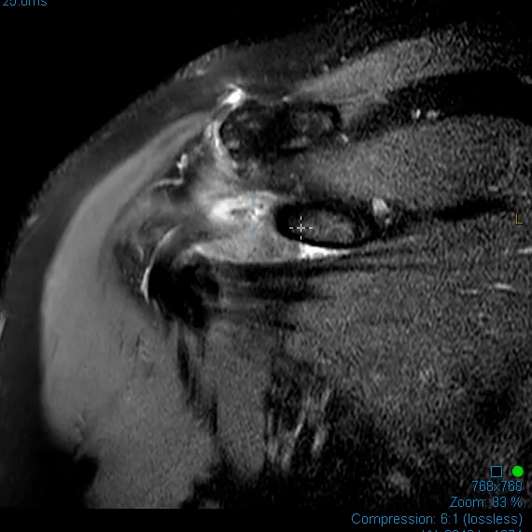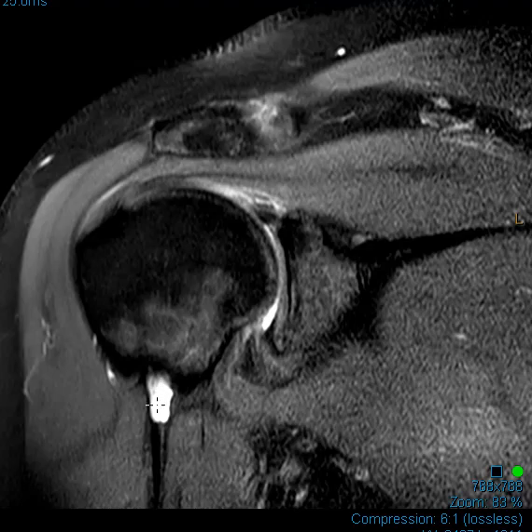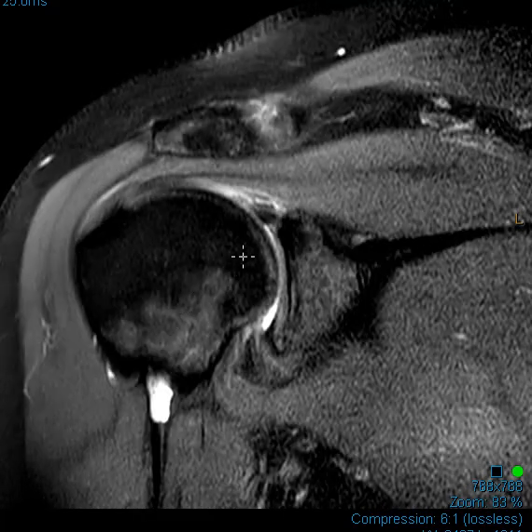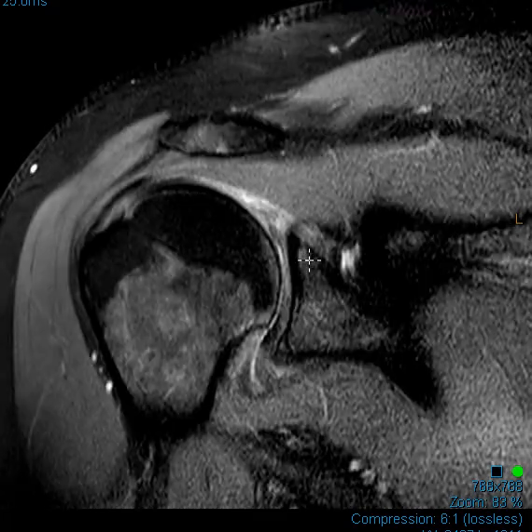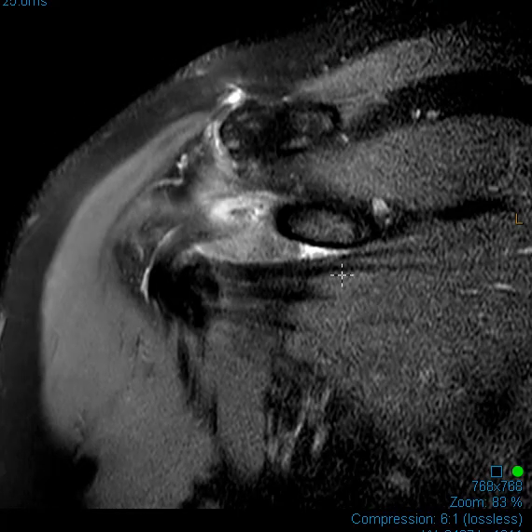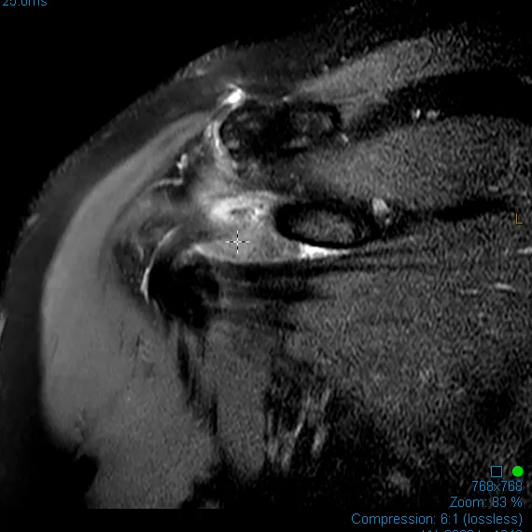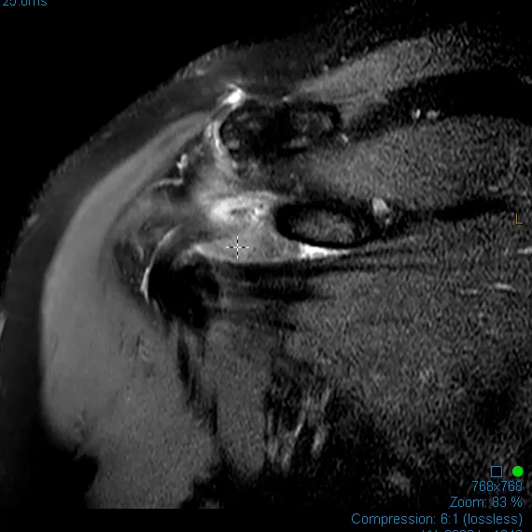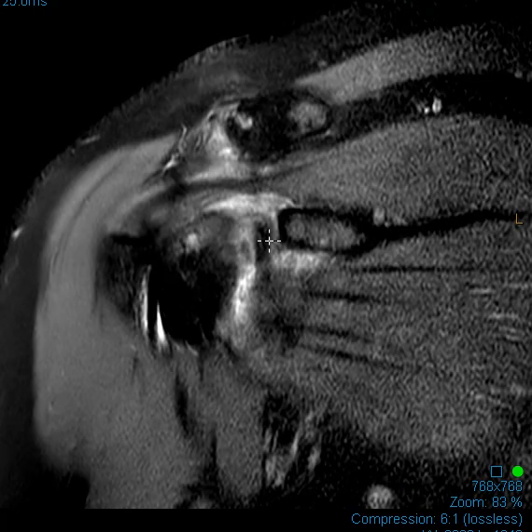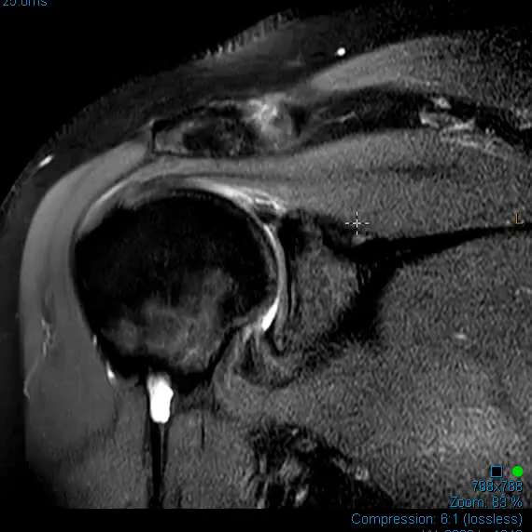Here's another view where fluid should be bright. We see fluid in the biceps tendon sheath over here — a little tenosynovitis. Here's that superior labrum. Now we're going to look at the inferior joint capsule that is too thick, and roll forward to this special area. Right in here, this is the subscapular muscle, this is the tendon, and right above that in the rotator interval area, we see this intermediate signal, kind of speckled. This is a big mound of inflammation — adhesive capsulitis associated with, or incited by, this labral tear.